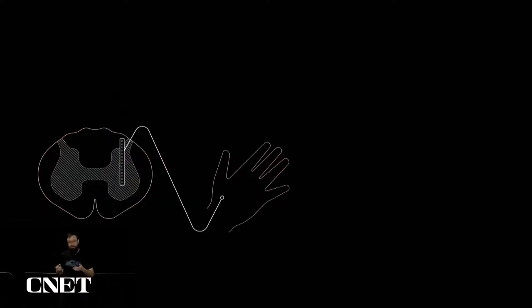Now, of course, movement without sensation is actually kind of difficult. Just think about what it would be like to try to move your limbs if they're numb. But we can also get sensory information as well. So the sensory consequences of your movement can be recorded in the dorsal horn of the spinal cord in the form of spikes. For example, here, a feather touching the hand.